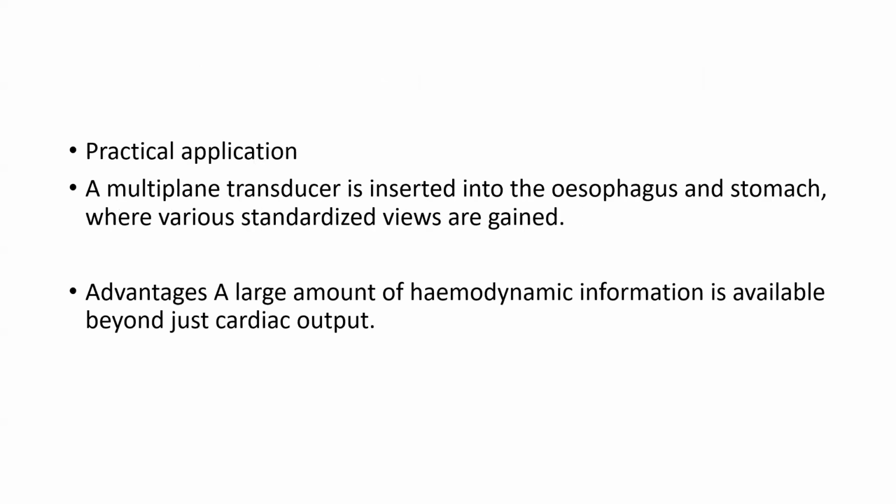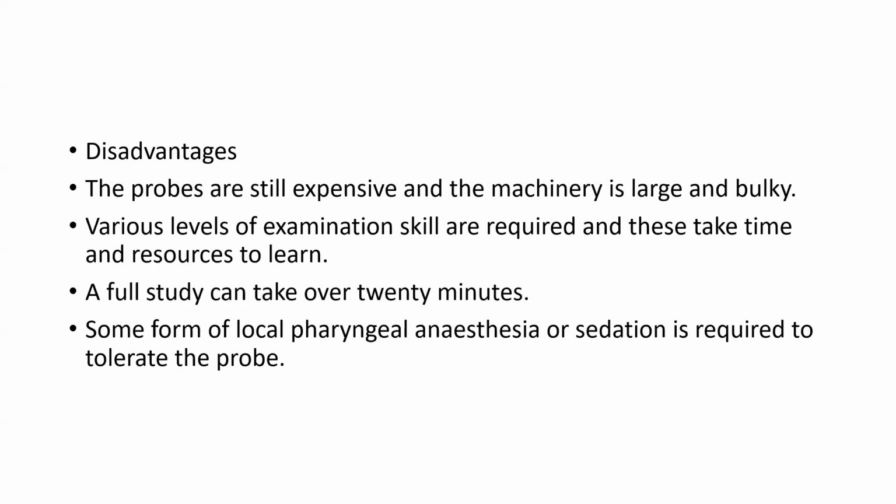Now, about practical application, the multiplane transducer is inserted into the esophagus and stomach, where various standardized views are gained. Advantages: a large amount of hemodynamic information is available beyond just cardiac output. Disadvantage: the probes are still expensive and the machinery is large and bulky.